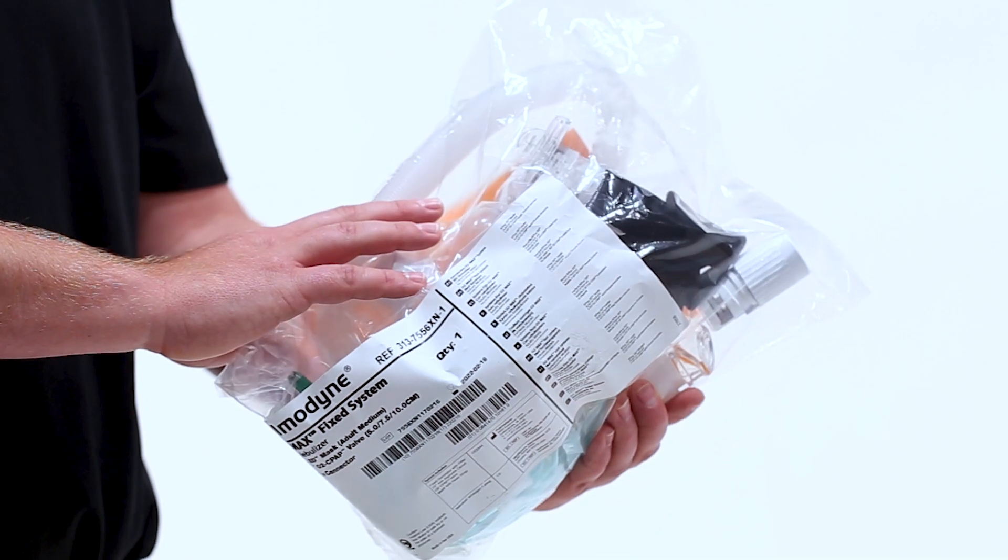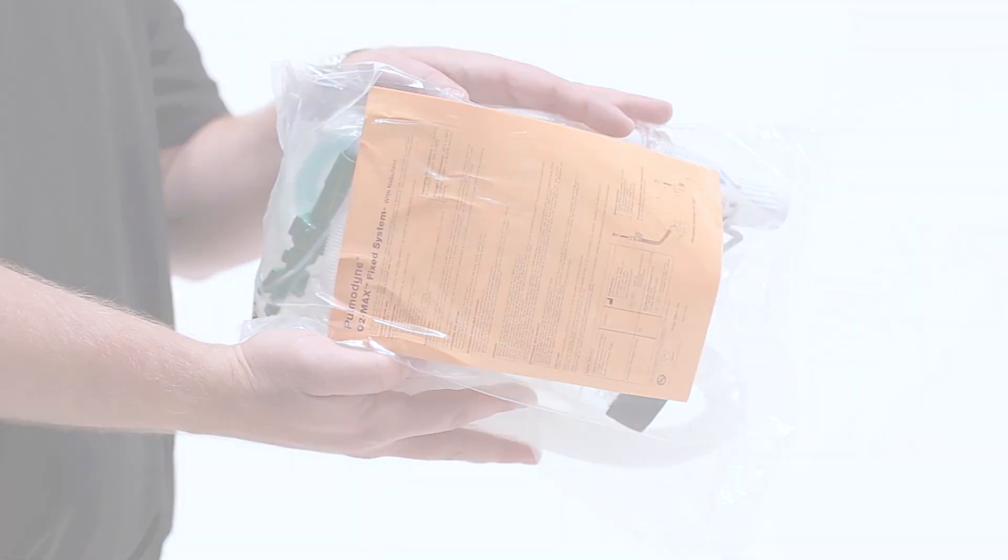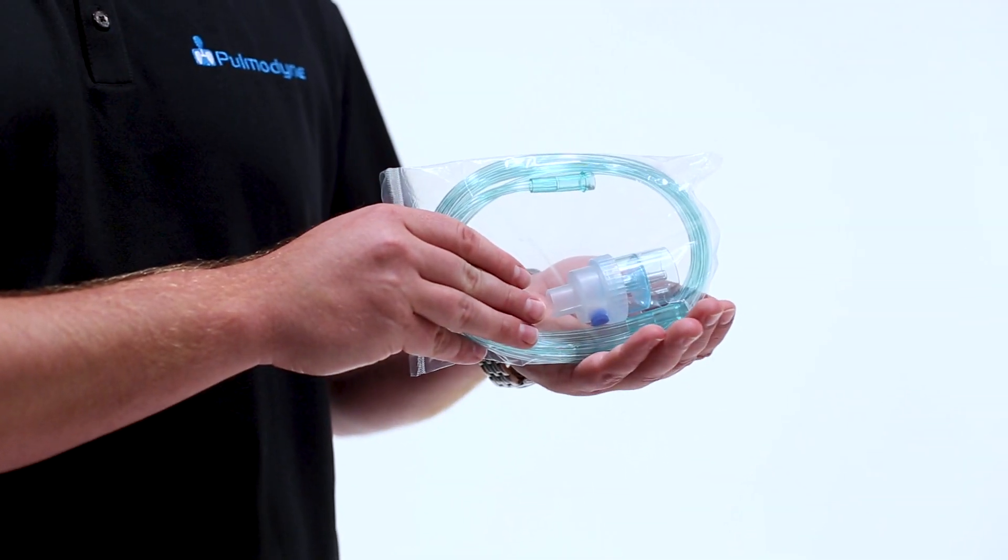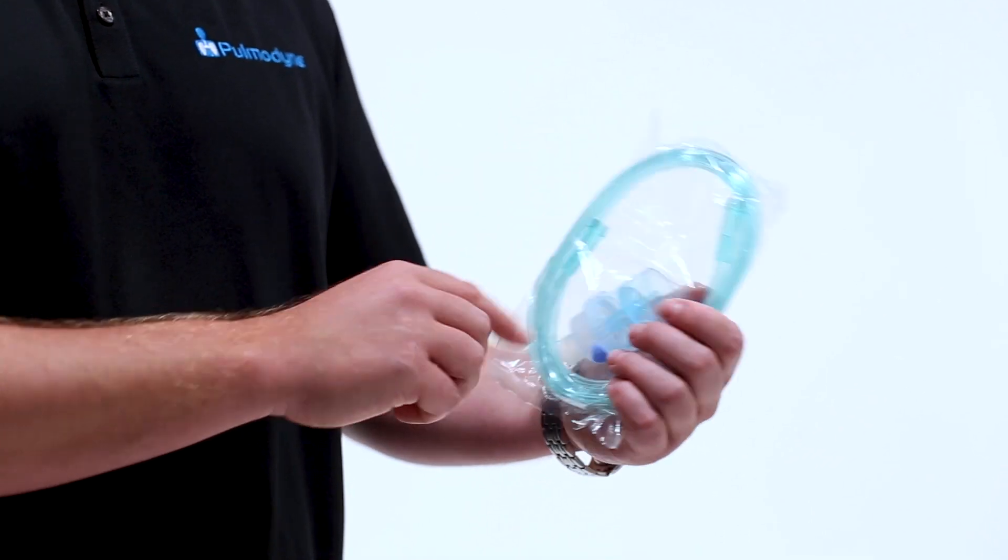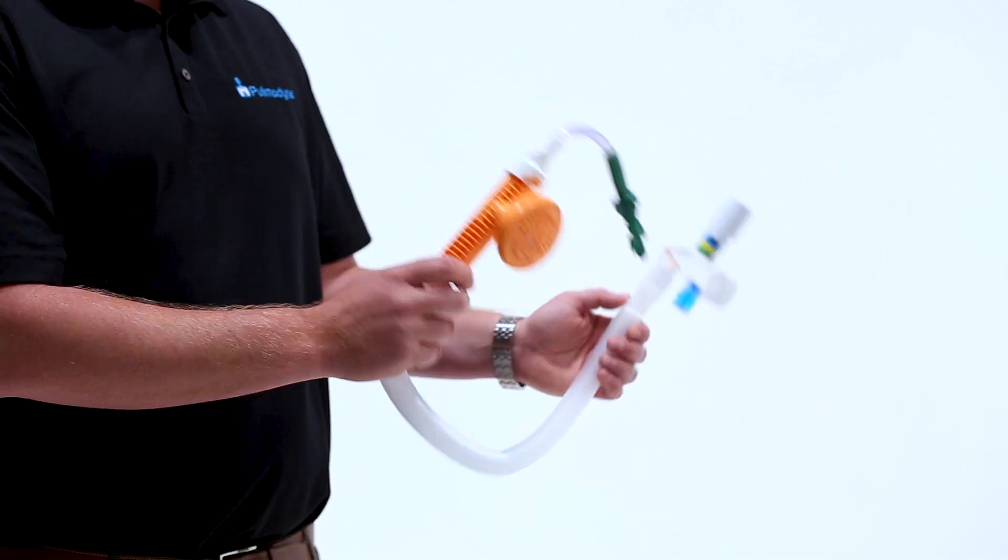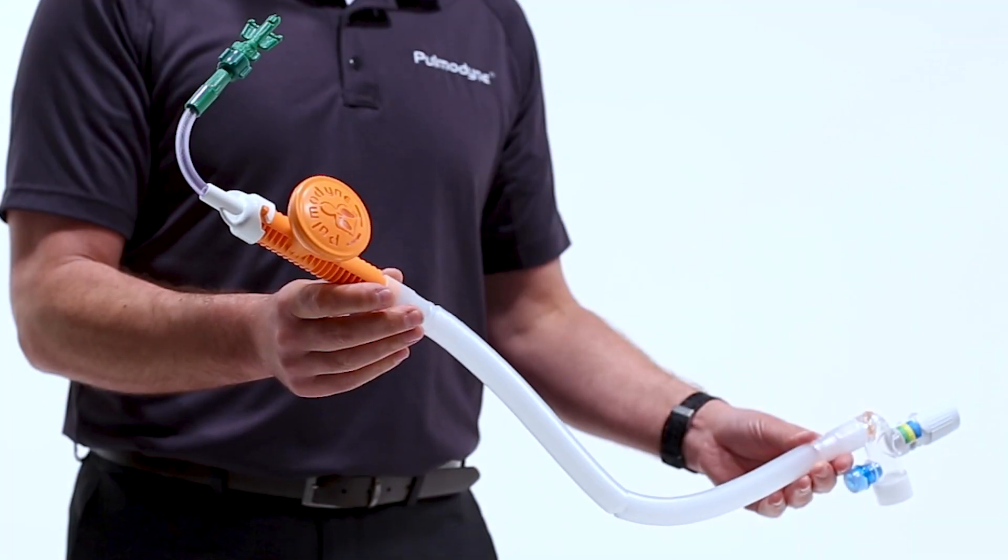The O2 Max with nebulizer comes in a small pack with a label that clearly illustrates the contents and size. Within the bag you will see the following items: directions for use, one BiTrac ED mask in a Ziploc bag, a nebulizer sealed in its own bag to use later if needed, the O2 Max generator itself, and vent tubing and elbow. This is part of the system that comes pre-connected to enable quick and easy CPAP application.